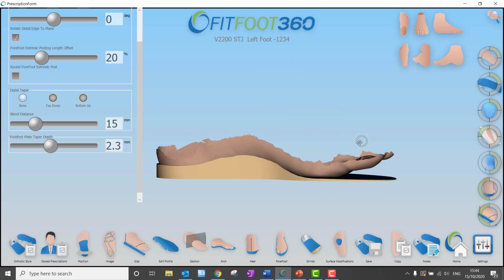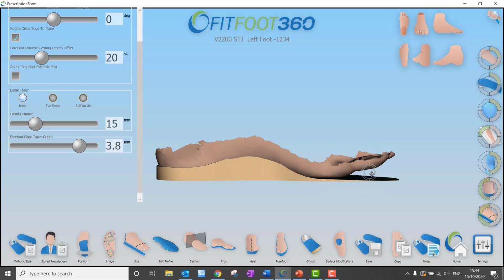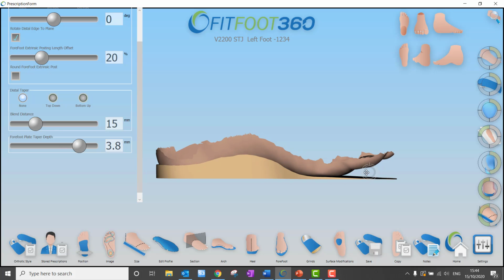It is worth noting that obviously if you do decrease this to something very, very small, you can get breakthroughs and you can get something that's extremely thin. So that's just also worth taking note of.